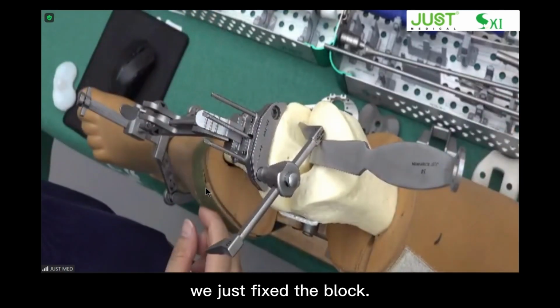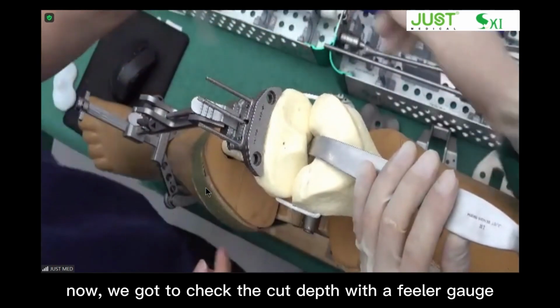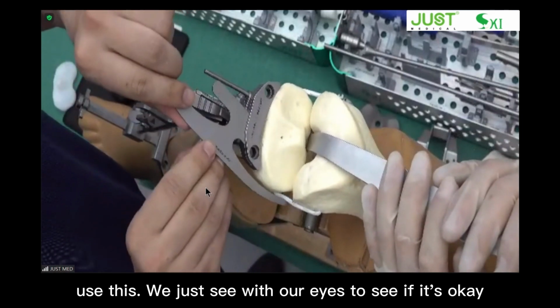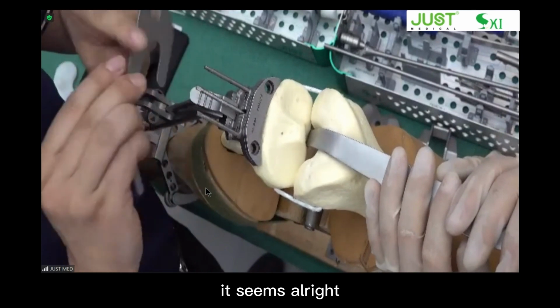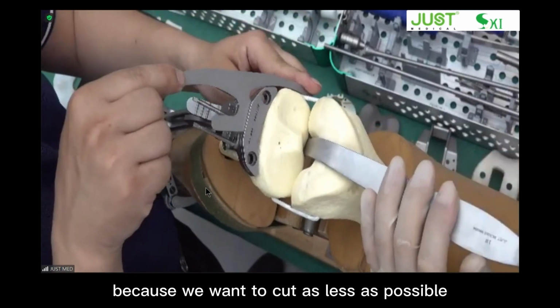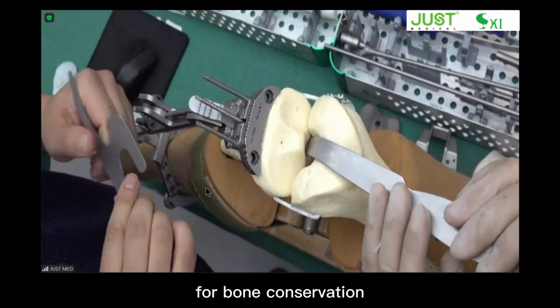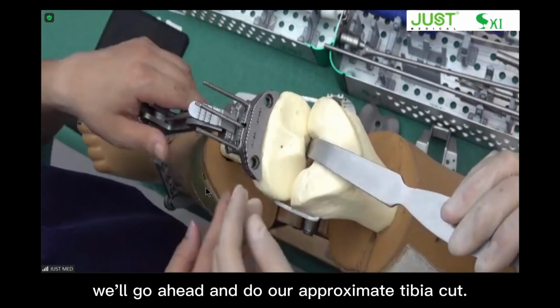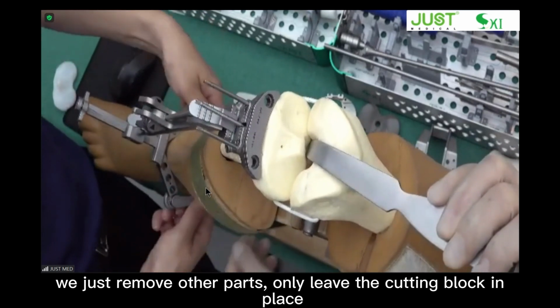Yeah, we just fix the block. Now we got to check the cut depth with the feeler gauge. And we just see with our eyes to see if it's okay. It seems all right, because we want to cut as little as possible. Bone conservation. If everything's all right, we'll go ahead and do our proximal tibial cut. We just remove the other parts, only leave the cutting block in place.